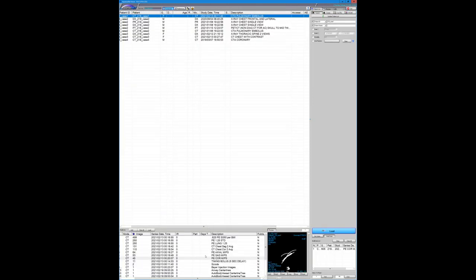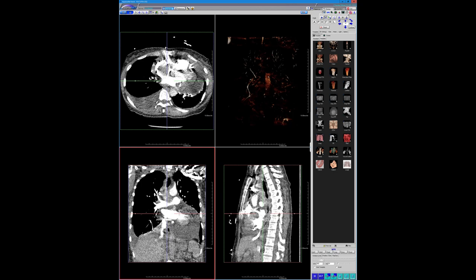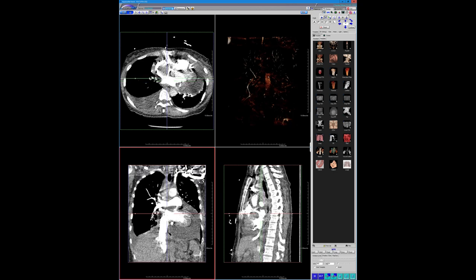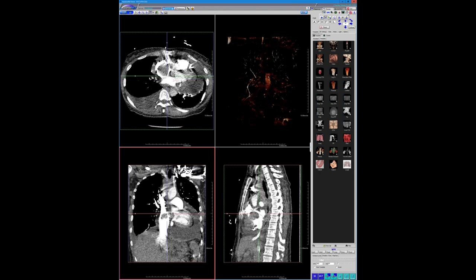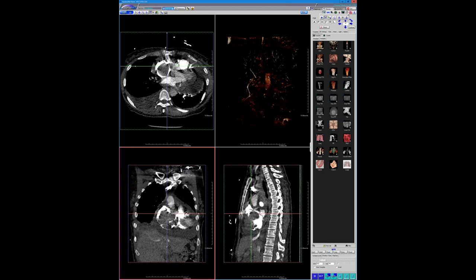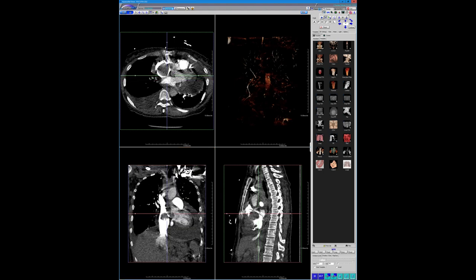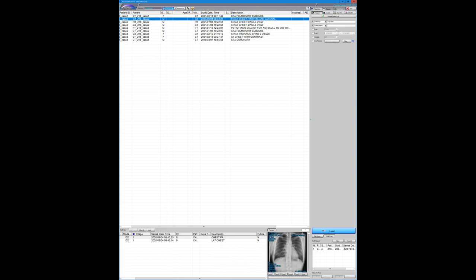The main differential when you see this would be either a metastatic lesion, which is always possible, or a lymphoma. This was a cardiac lymphoma, presumably secondary, given that the patient had lymphoma involvement elsewhere. It can be really hard to differentiate primary cardiac versus secondary lymphoma, but she had lymphoma involvement throughout including her pericardium. Secondary is just much, much more common. The nodal disease outside of the heart would speak to secondary. The very low attenuation on CT is kind of classic for lymphoma.